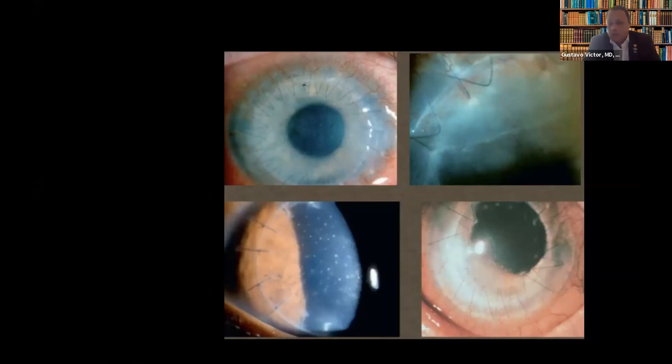You can see the vascularization, but also in the host cornea, you can see the line here. In the upper pictures, you can see the line between the clearer and the darker cornea. You can also see how thin the suture is here on the left. So this cornea is a little older. Usually we take out the suture after 1 year in the PK transplant. Usually after 1 year of PK transplant, very often I take them out, because the veins are coming through the suture.